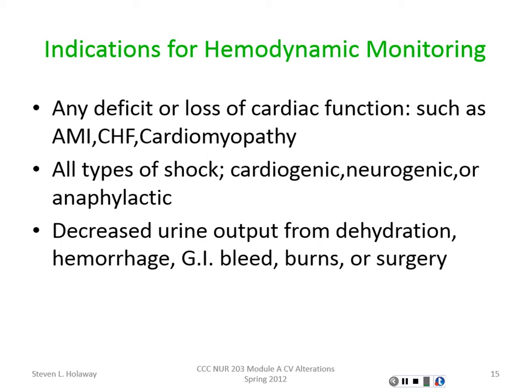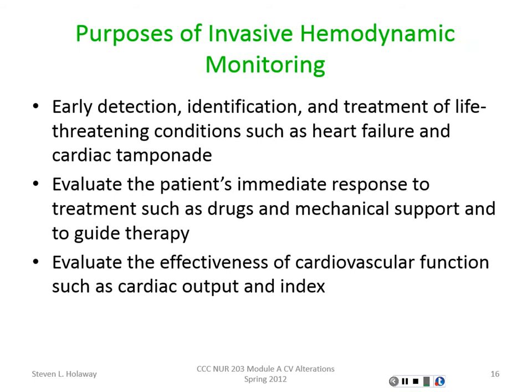If we really need to monitor the fluids on a patient, you're seeing a move away from using these to just monitoring central venous pressures. But if you want more information, a lot of times they'll use these, especially for patients with massive trauma where we're trying to manage the hemorrhaging, patients with severe GI bleeds. A lot of the severe burn patients may see a Swan until we can get that going. And a little bit later this semester, Ms. Lee will be talking about fluid management of the burn patient, which is quite intense.